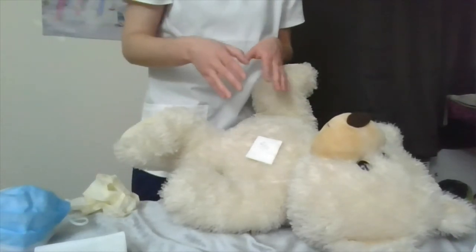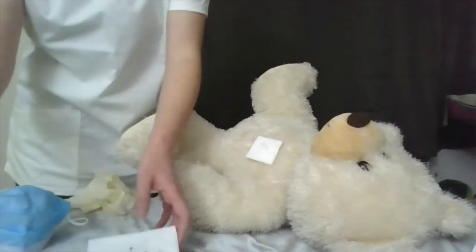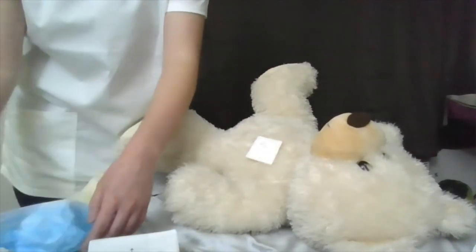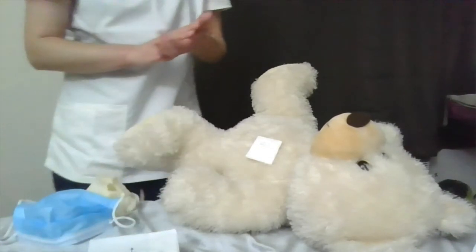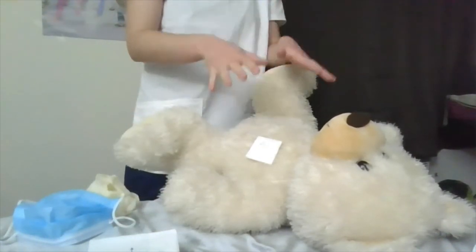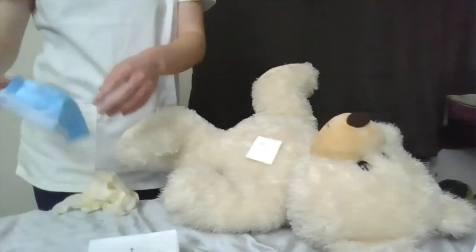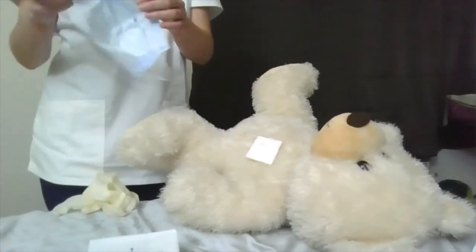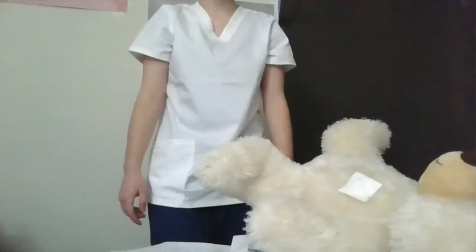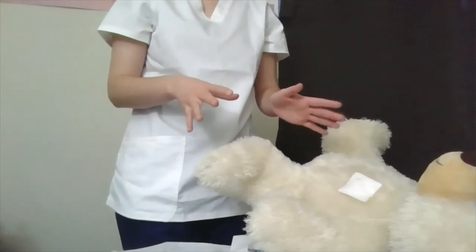I'm going to begin the assessment and gather all the equipment I need: a new dressing, cleaning equipment, and bandage. I'm then going to have the patient position on their back to prevent an air embolism. I'm going to apply a face mask to my patient and have them turn away. I'm now going to perform hand hygiene before I begin changing the dressing.